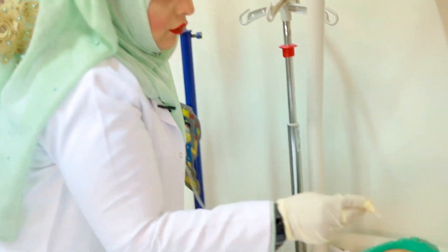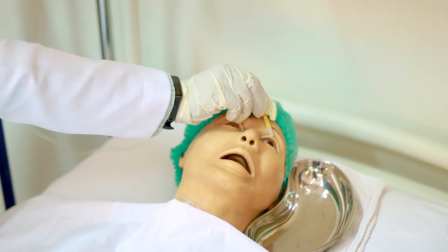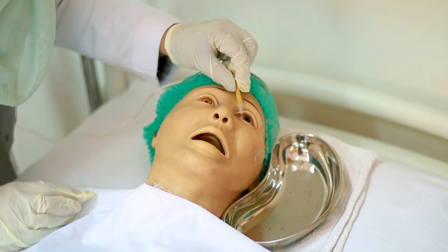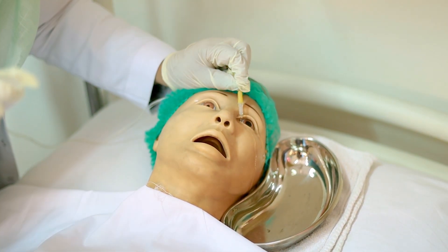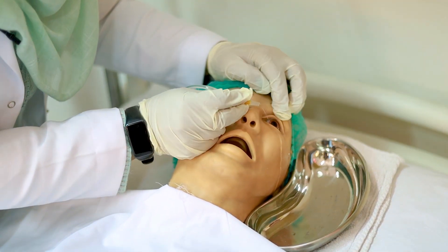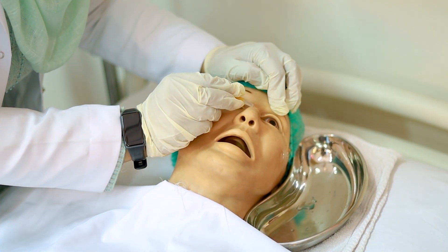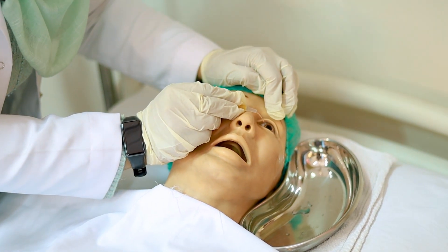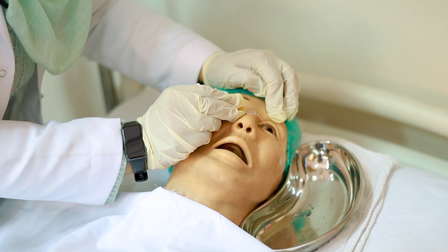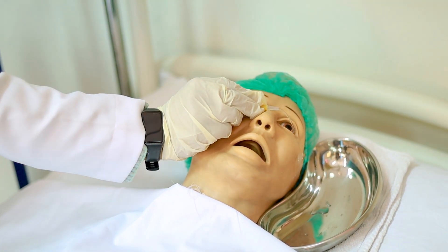Now the patient is looking upward. Your hand will be up to the middle of the eyebrows and directed into the eye. The flow is very low. We have to clean the lower lid and then clean by holding the upper lid and the whole eye. At the same time the patient is looking upward, so we are not hitting the cornea. We will clean until desired. Eye irrigation is done.